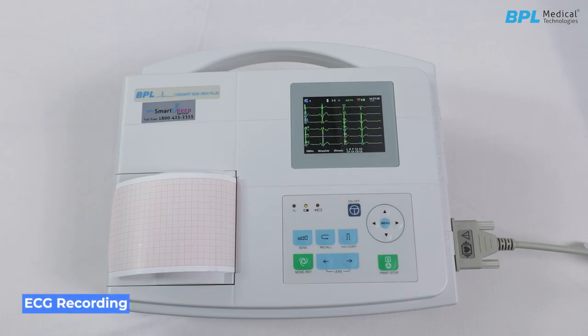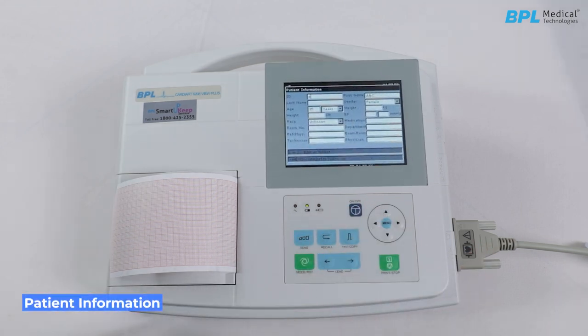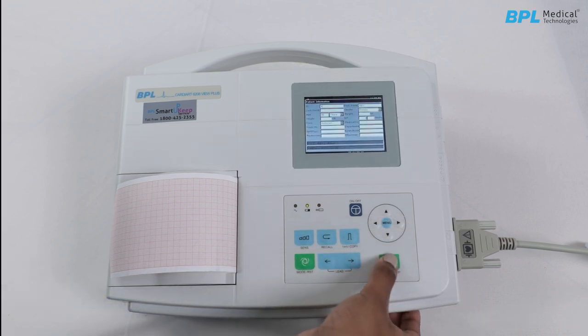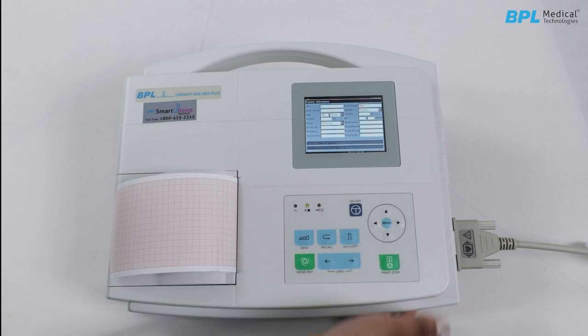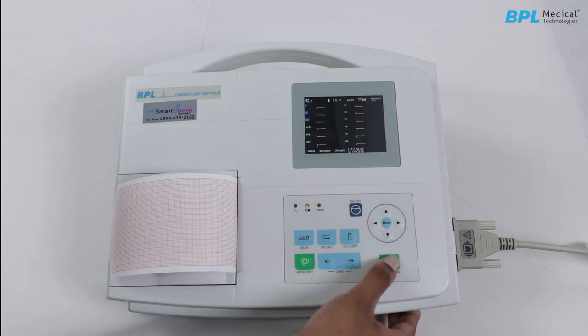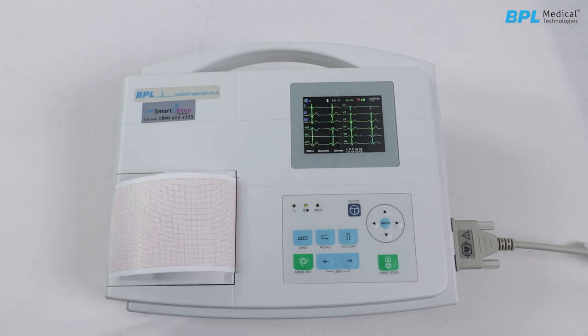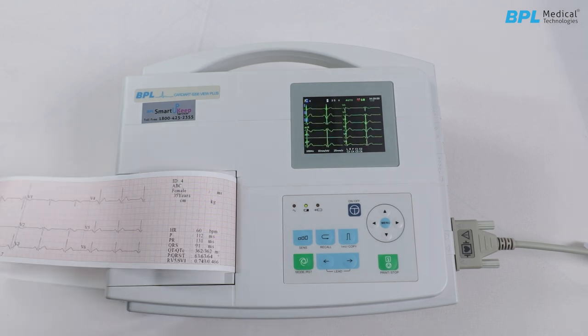To record the ECG in auto mode, press the mode or reset key to select auto mode. Then press patient information, use the navigation up/down key, enter patient information using the navigation right key to edit or select, then press OK. Use the navigation down key to go to first name, last name, change the gender, age, and save using the print or stop key. To record in manual mode, press mode or reset for manual mode. The same can be done for rhythm mode.